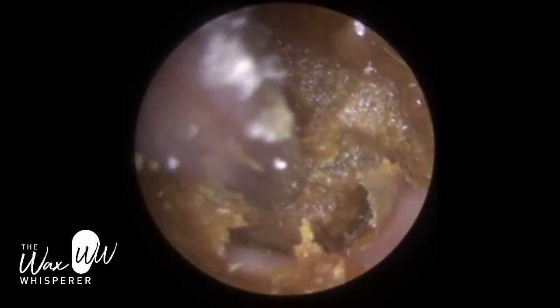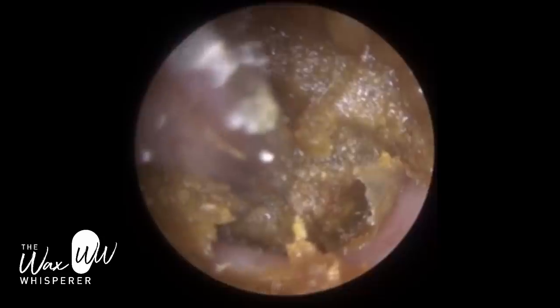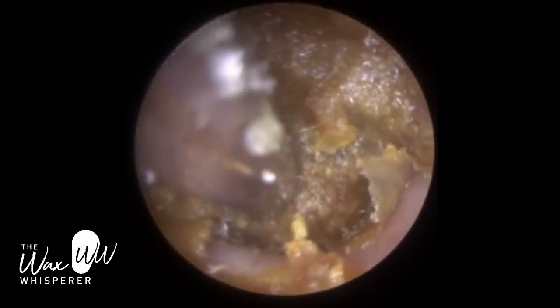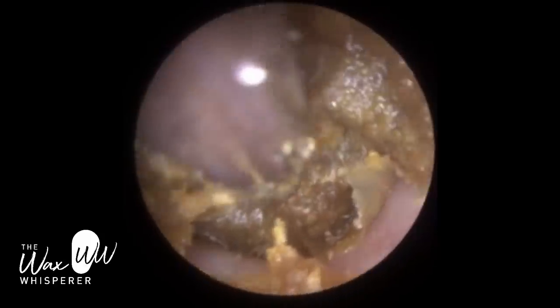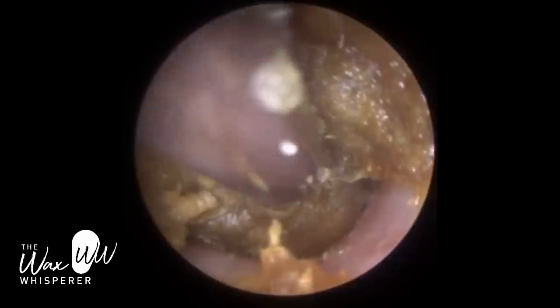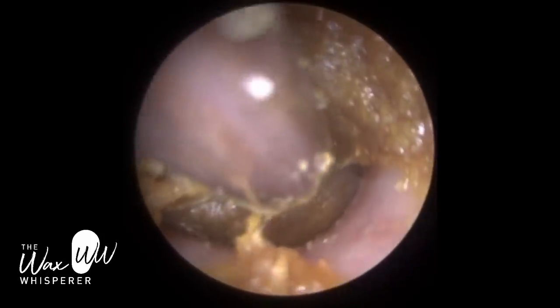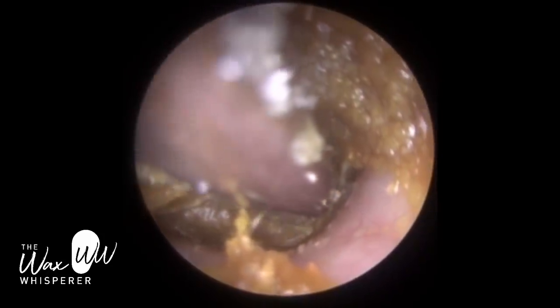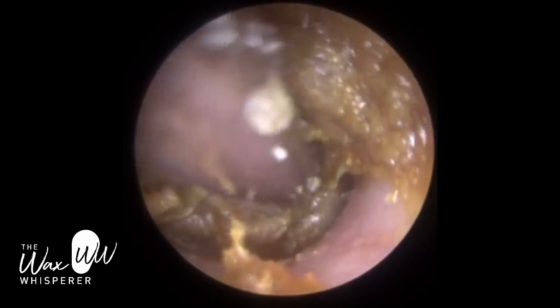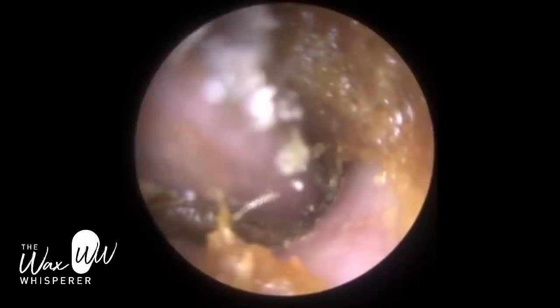In some cases, we do have to remove the wax, especially if it's dead skin adhered to the wax off the canal wall. If you peel that off from the sides first, that can facilitate removing the main lump or body of wax that's impacted. But in this case it wasn't going to, so I just wanted to focus on the main body.